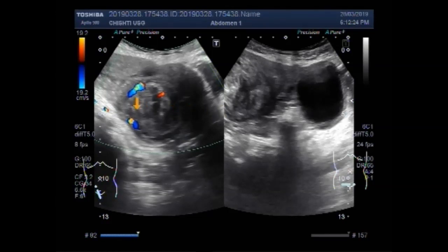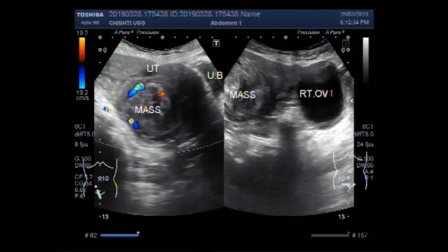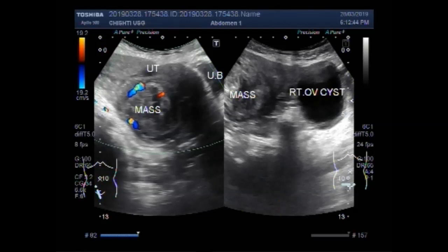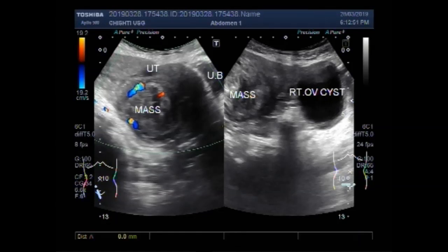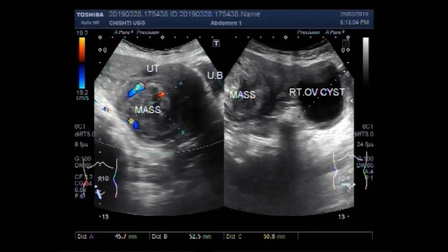This is the uterine mass. This is the urinary bladder, this one is the mass, and this is the right ovarian cyst. You can see the size of the uterine mass — it measures about 52.5 mm x 45.7 mm. The ovarian cyst measures about 50.8 mm x 49.8 mm.